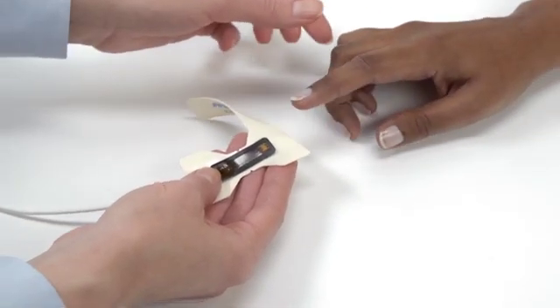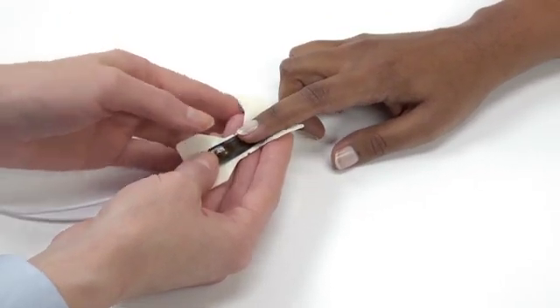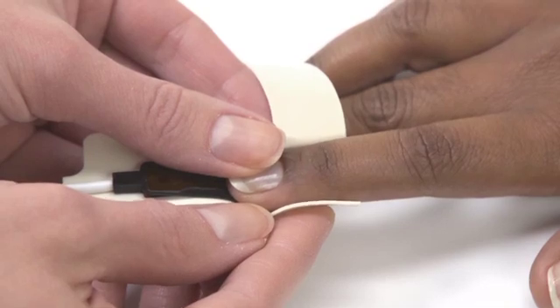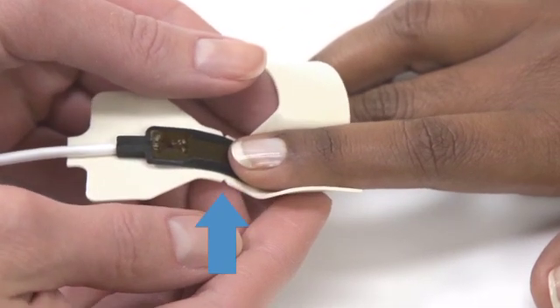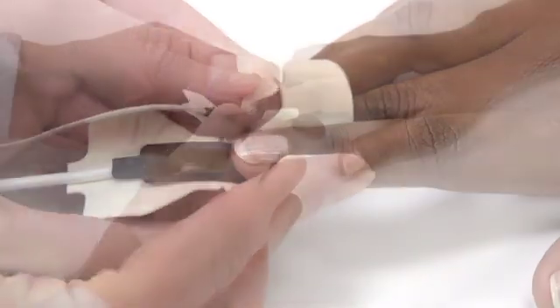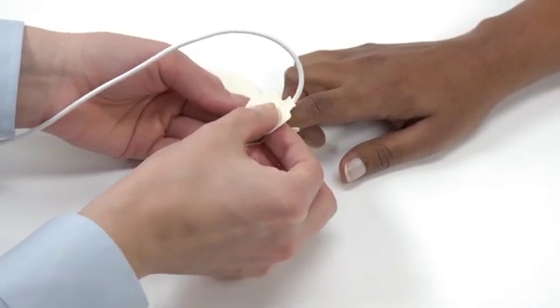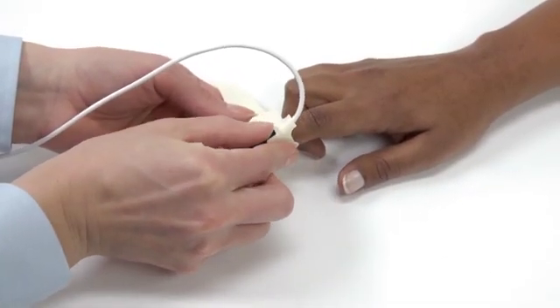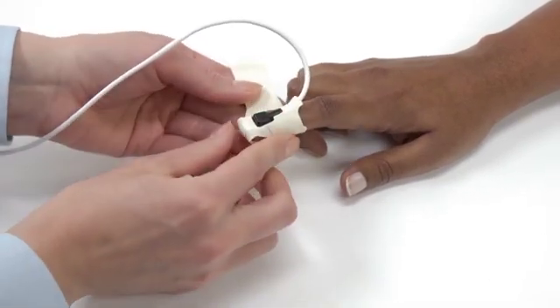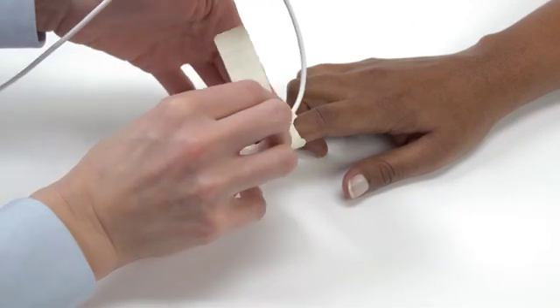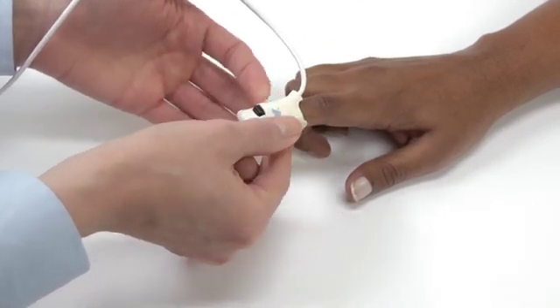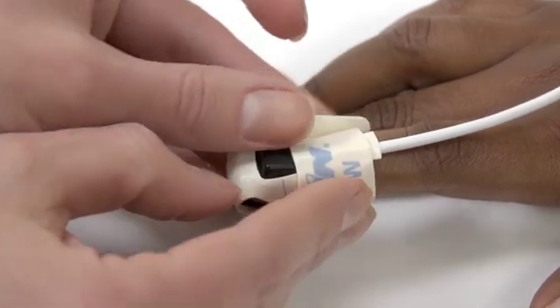Next, place the finger over the emitter with the fingertip at the notch in the wrap. Put the fingertip to the middle, evenly spaced between the emitter and detector at the center mark. Press the adhesive flaps on the sides of the emitter onto the skin. Now wrap the sensor on top of the finger. Press the adhesive flaps on the sides of the detector onto the nail and skin. Gently wrap the tab around the finger to overlap the emitter and secure the sensor to the finger.